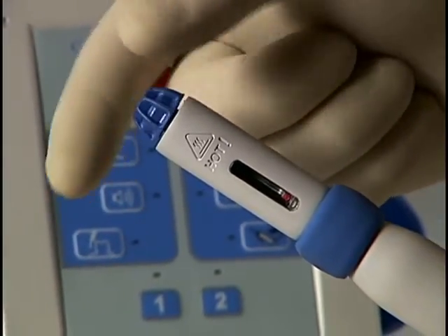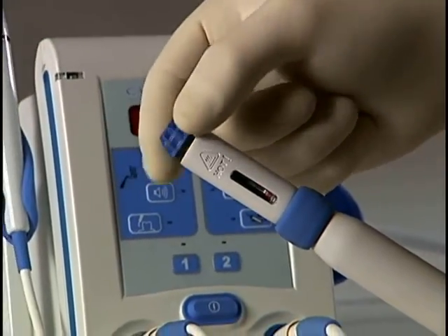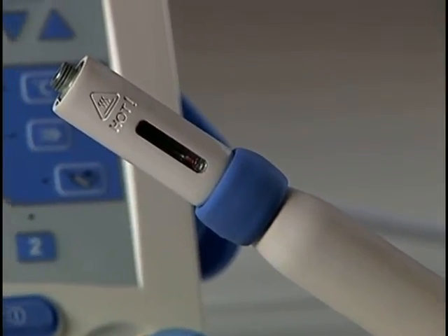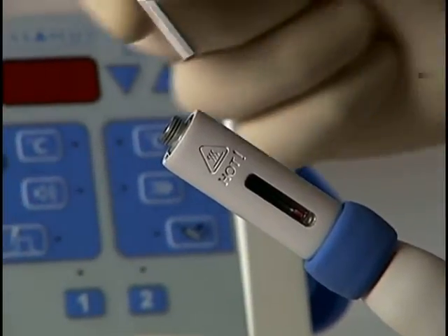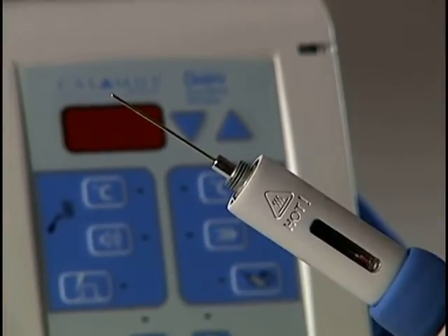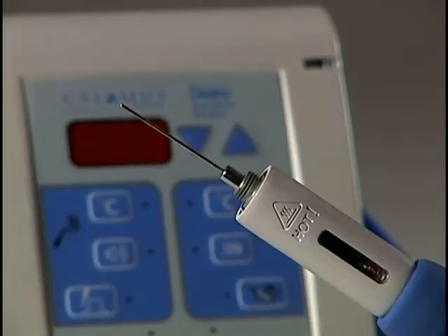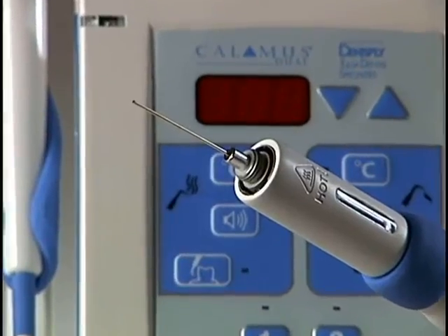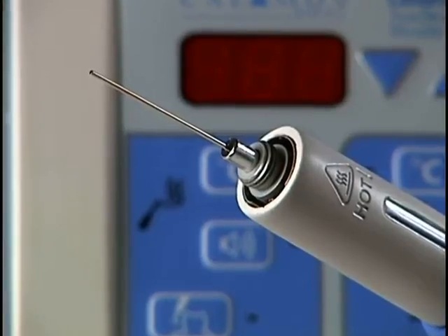Loosen and remove the nut on the end of the handpiece. With the plunger fully retracted, gently insert a sterilized Calamus Singles Gutta Percha cartridge into the end of the handpiece with the needle end pointing out. Ensure that the cartridge is seated completely in the handpiece. When fully seated, only 4 to 6 millimeters of the cartridge portion should be visible.